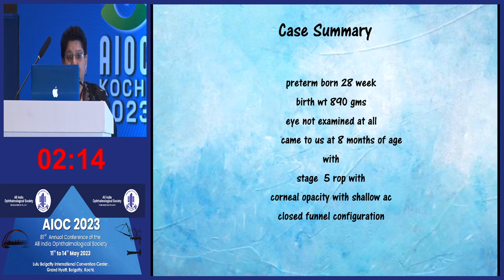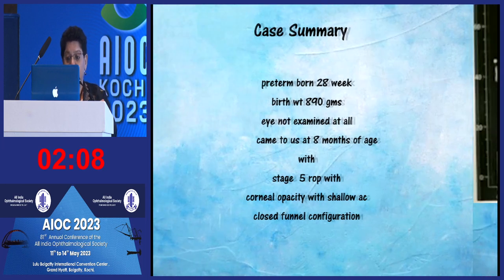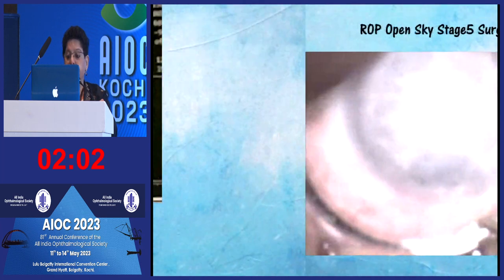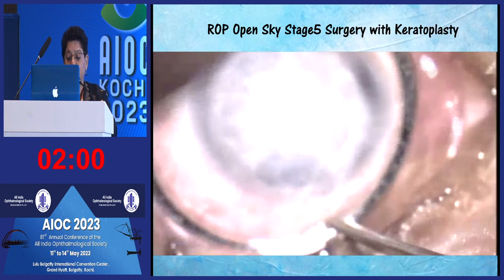Just the periphery was clear, where you could see that he had a shallow AC, and the USG showed a closed funnel configuration of the ROP. So this is how the condition of the patient was, and this needed a keratoplasty.